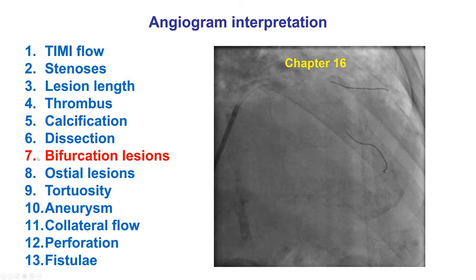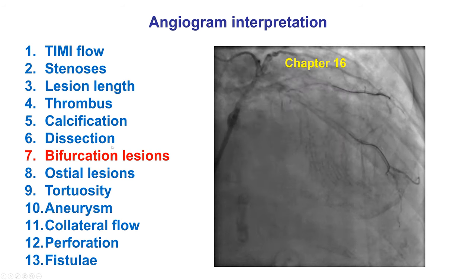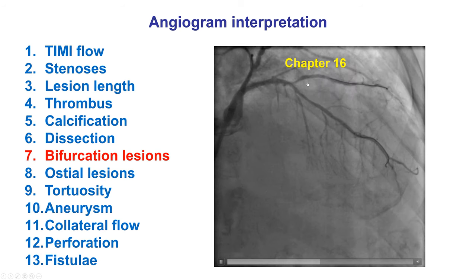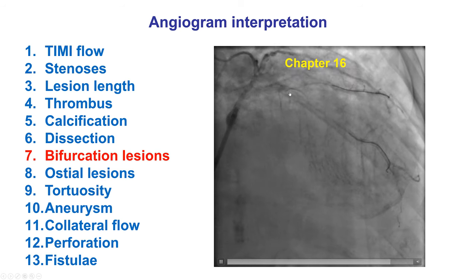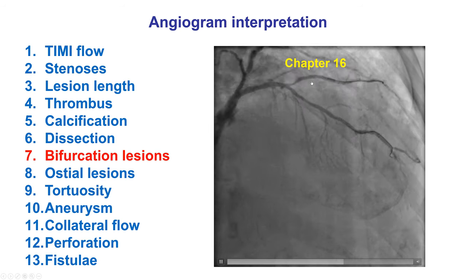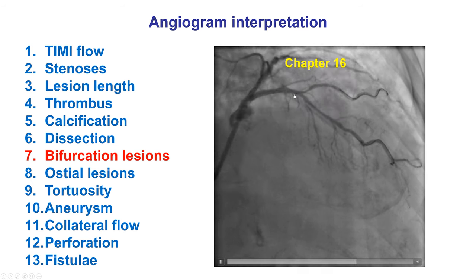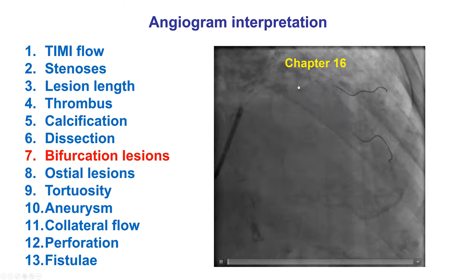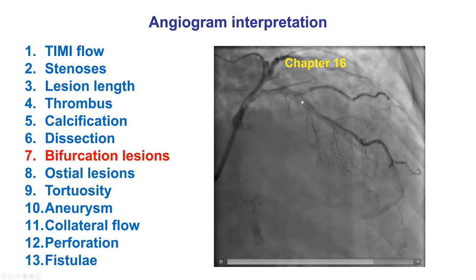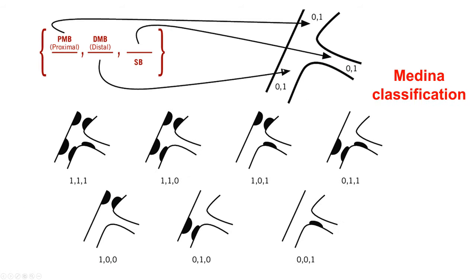Number seven of the characteristics to look for is the presence of bifurcation lesions, which are lesions where the coronary arteries split into branches. This is an example of an LAD and diagonal bifurcation lesion. Bifurcations are usually assessed using the Medina classification, discussed in detail in the videos from Chapter 16.